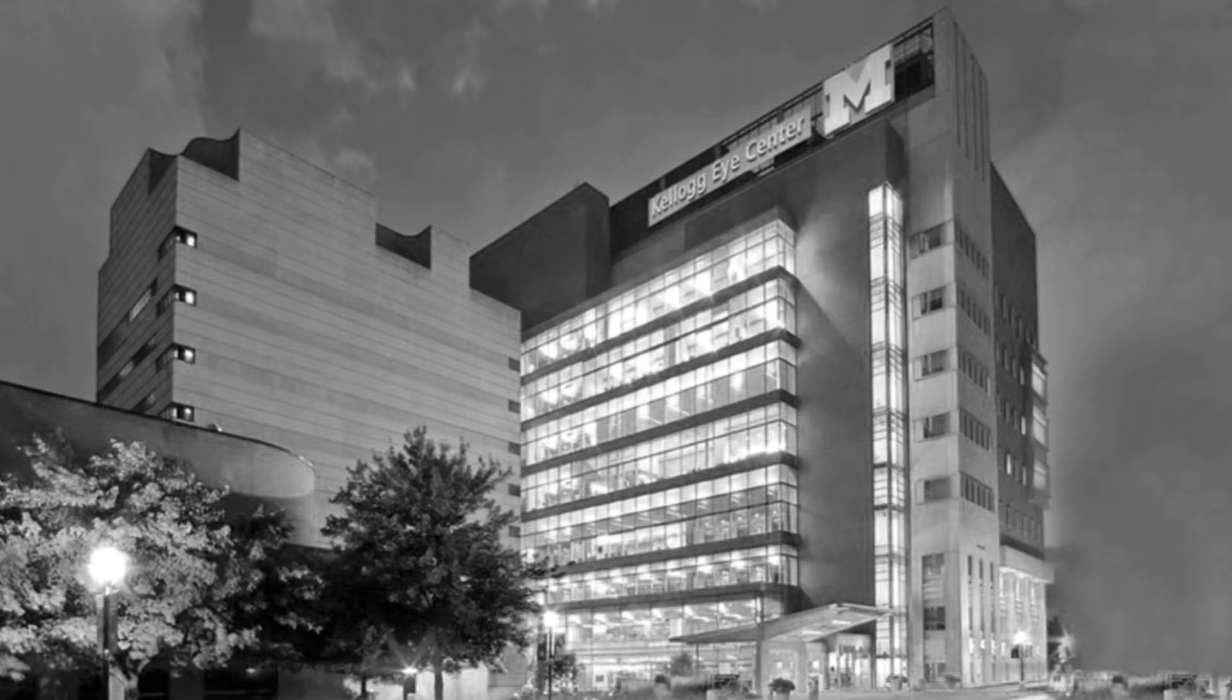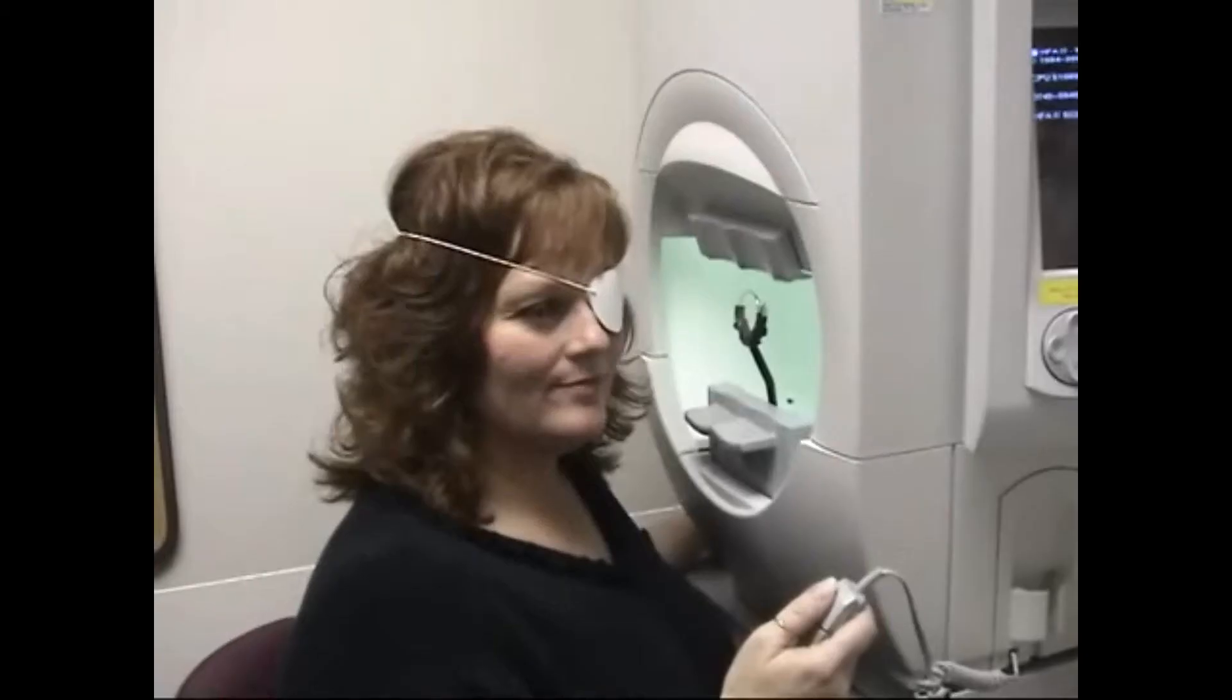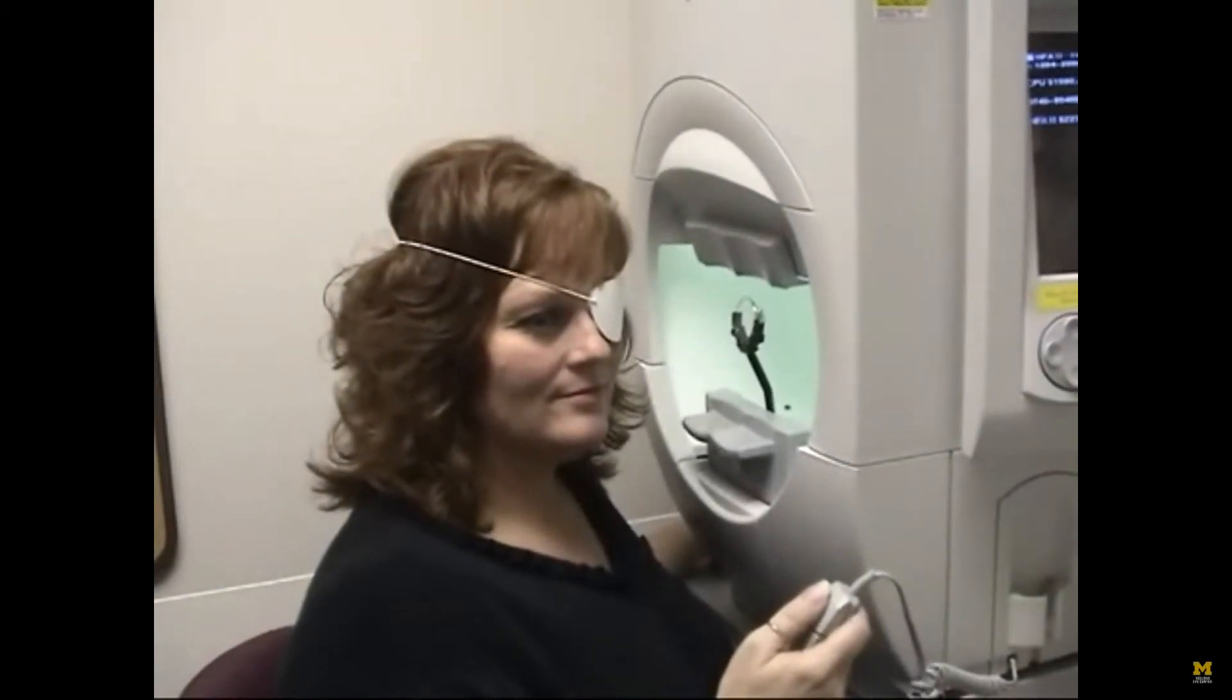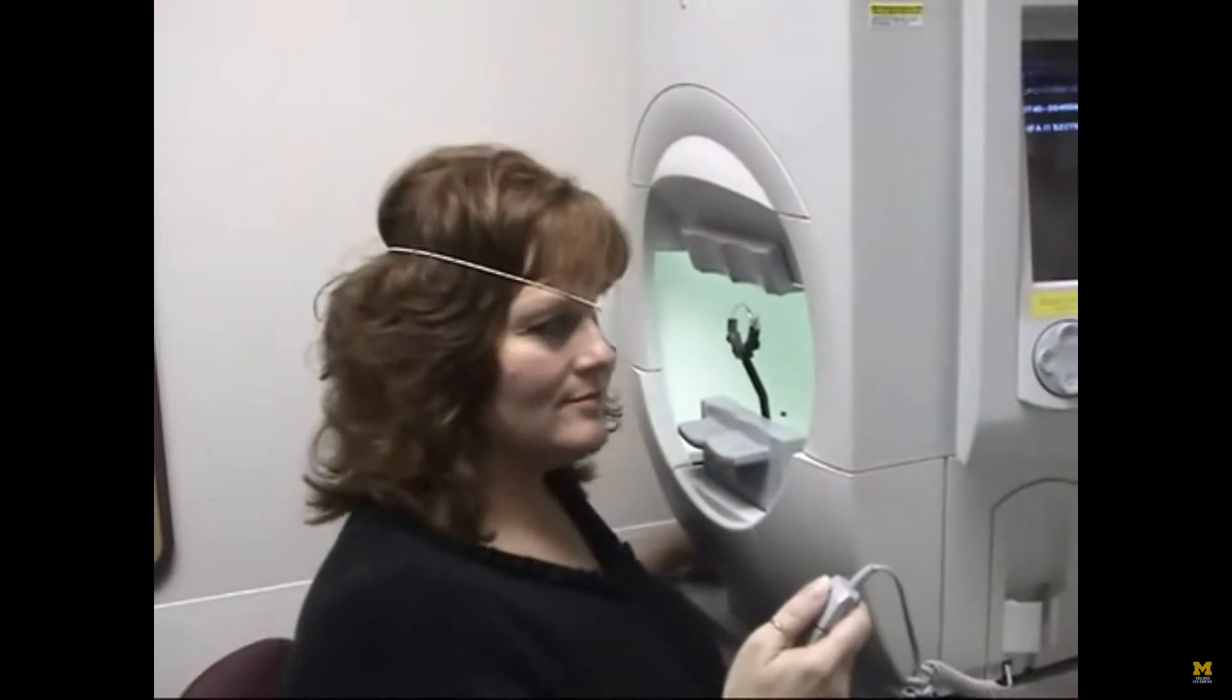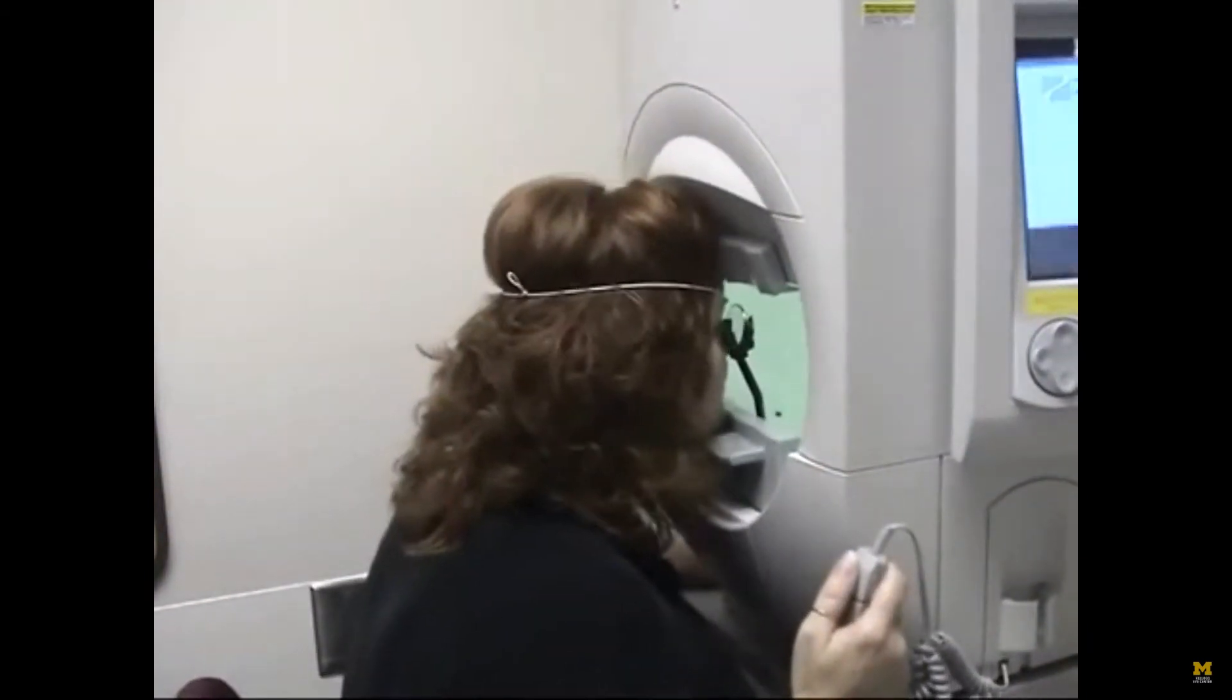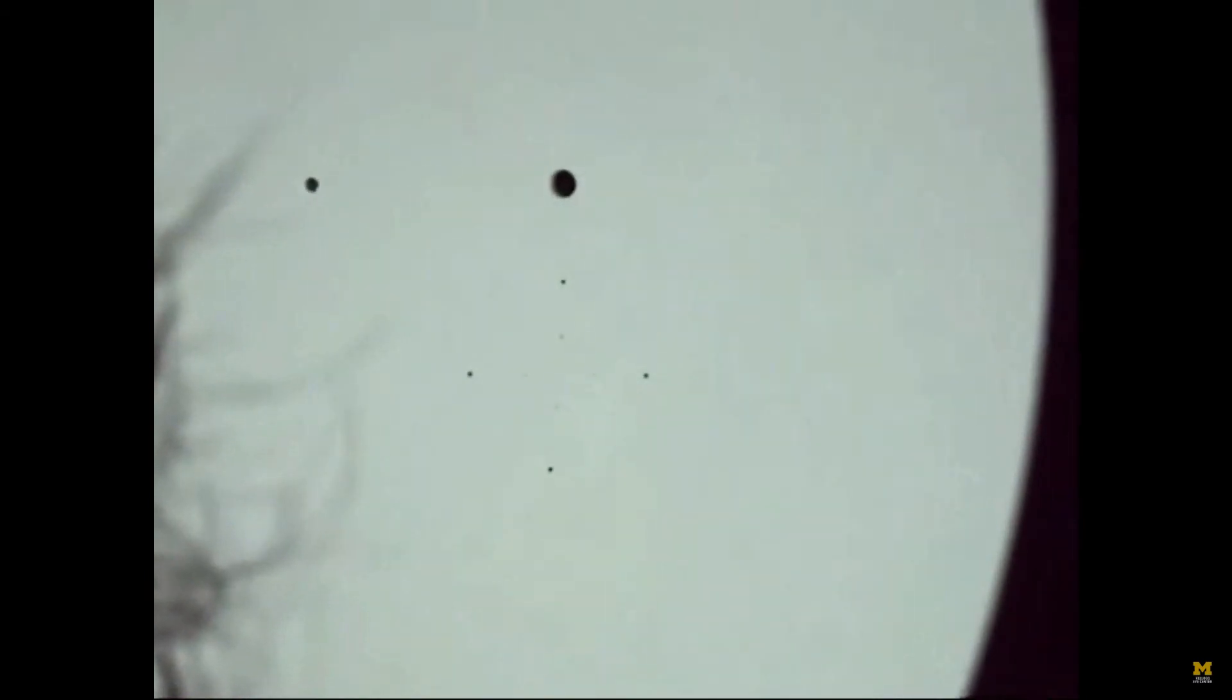Formal visual fields are a powerful diagnostic tool to assess the panorama of achromatic vision. Part 1 of this series showed you how they are performed. In this video, you will learn how to interpret the data produced by formal visual field testing.